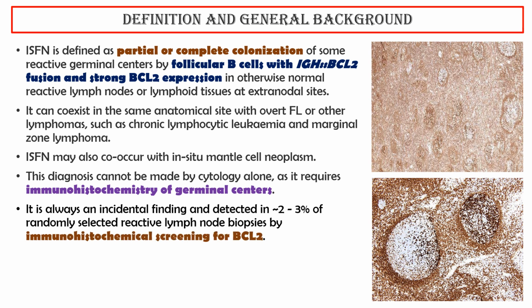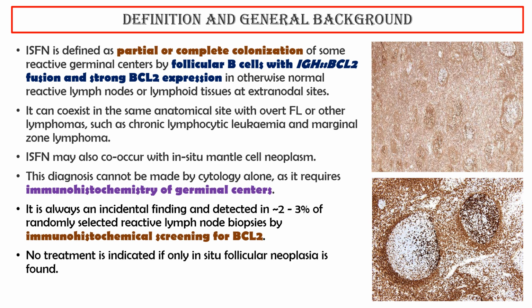It is always an incidental finding, detected in approximately 2 to 3% of randomly selected reactive lymph node biopsies by immunohistochemical screening for BCL2. No treatment is indicated if only in situ follicular neoplasia is found.